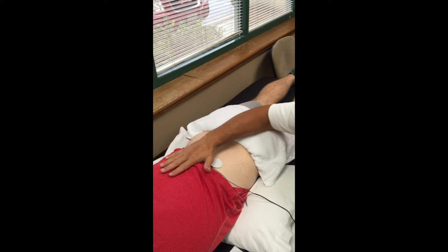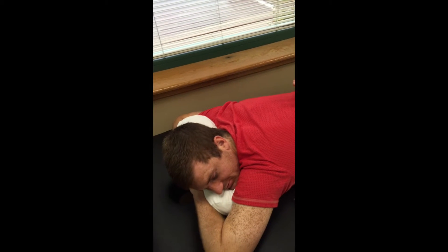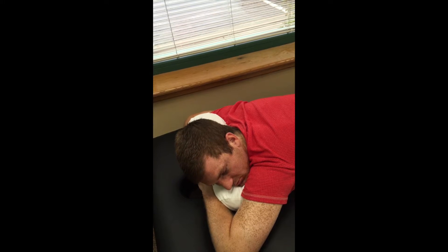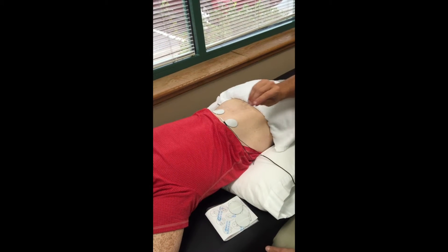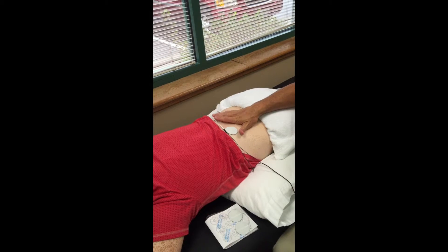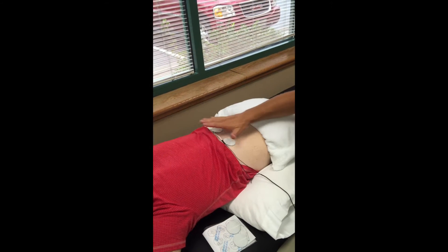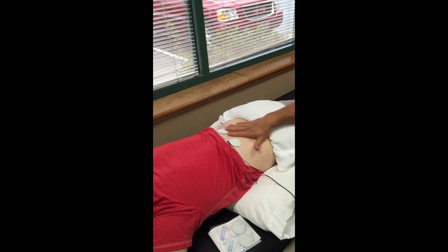One more time before we initiate — do you have any other metal in your body? No. And do you have any kind of mechanical devices like an insulin pump or a baclofen pump? No. And you do not have a pacemaker? No. And no active cancer in this part of the body? Okay, very good.